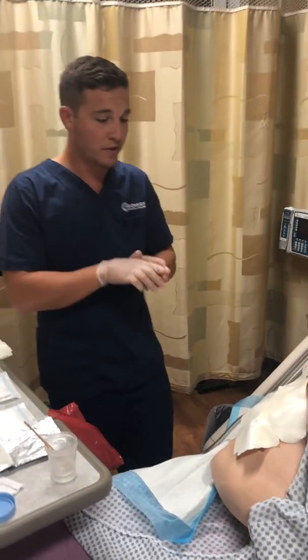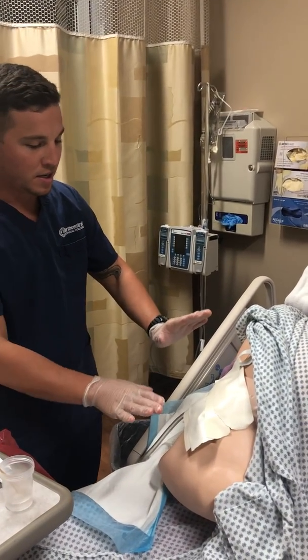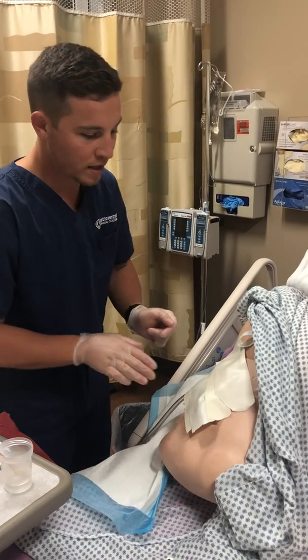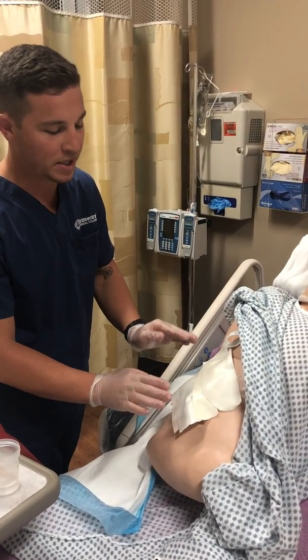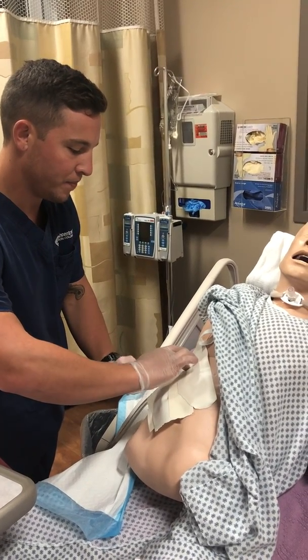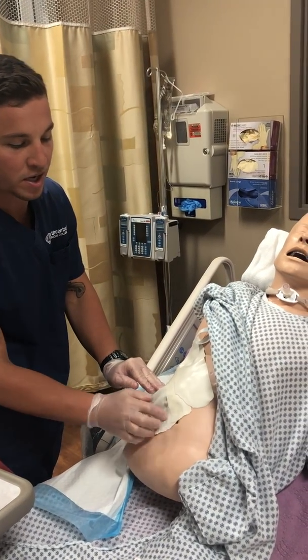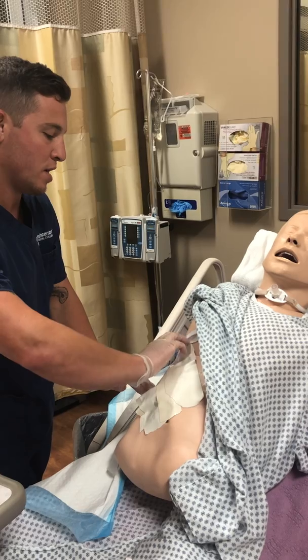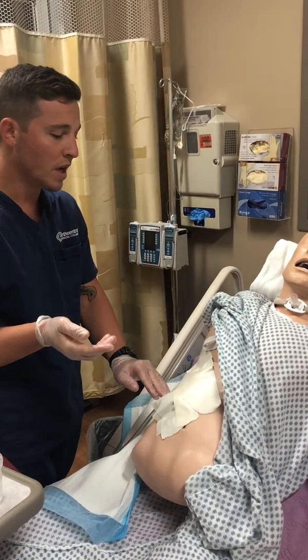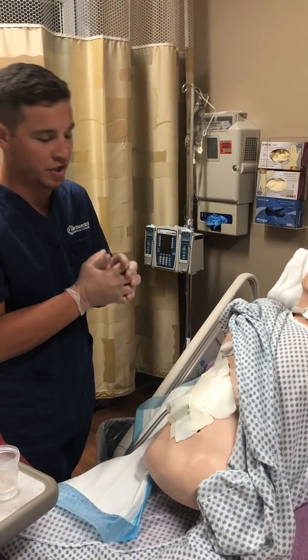Okay, so first thing is I'm going to look for any drainage or any shadowing on the outside of my dressing here, noting any if there were. The next thing we're going to do is feel for what's called crepitus. We're going to go around, starting near the insertion site, working our way around and out. If I was to find any, I would mark it, and then we'd continue to assess it. If it continues to get worse, that's when we would notify the physician.